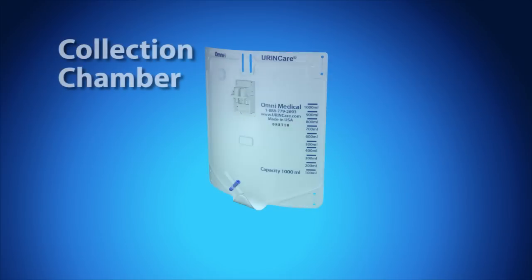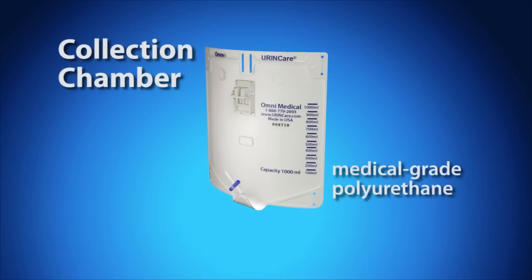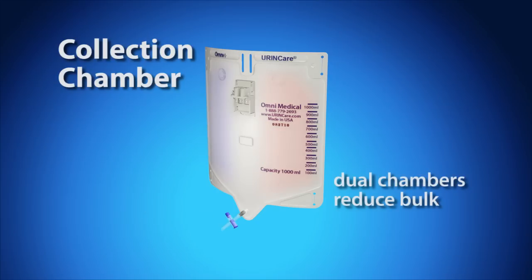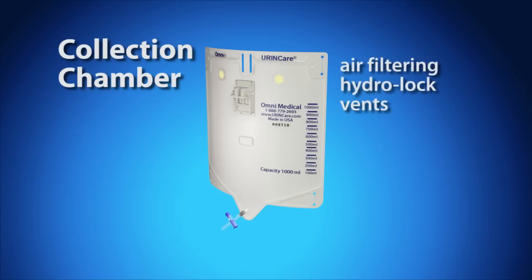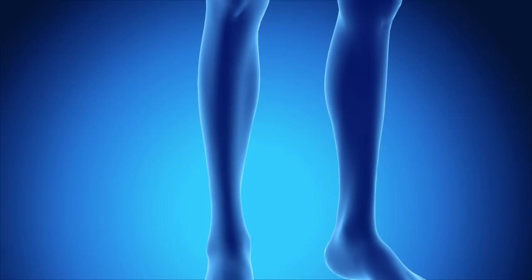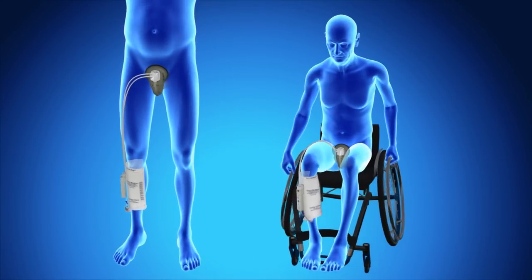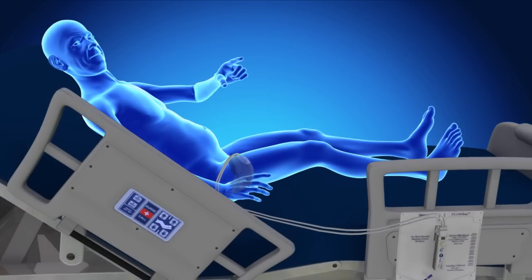The collection chamber is made from medical grade polyurethane. The drainage T-valve is easy to operate and can be opened or closed with one hand. Dual chambers allow the collection chamber to wrap around the leg, creating less bulk than a standard bag. Two air filtering hydro-lock vents allow air to escape but hold moisture in. A velcro strip wraps around the leg, allowing the collection chamber to be easily worn on the leg, thigh, or hung nearby.